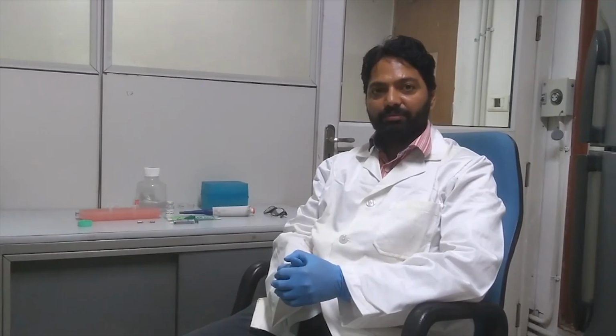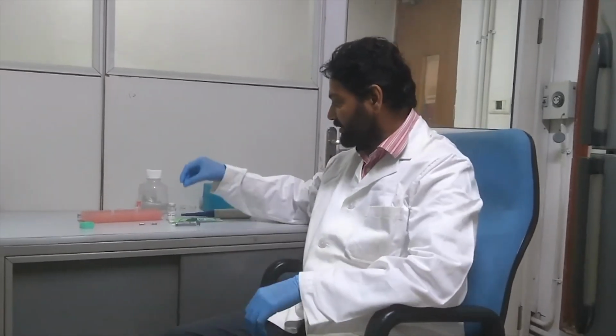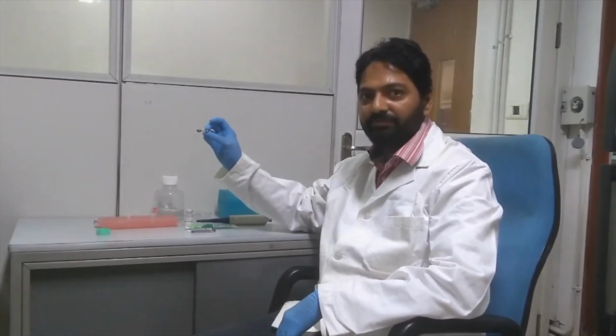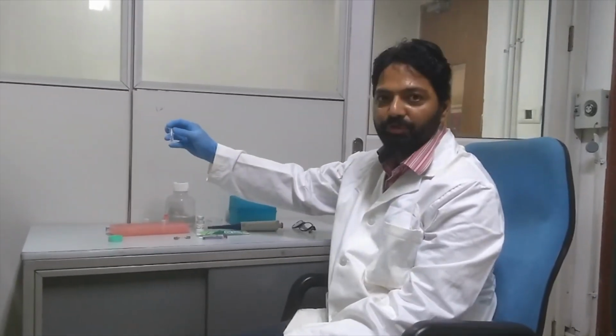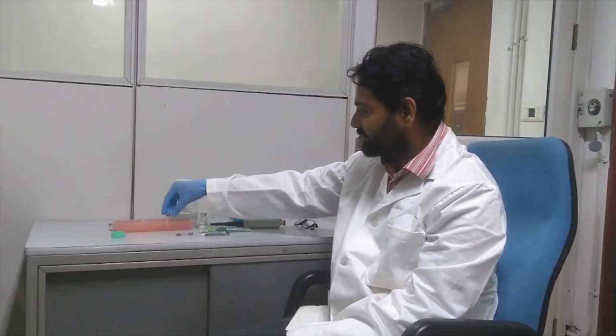I work in CSIR, CDRI. And in today's demo, we'll be discussing the different steps involved in the generation of antibodies in rabbits. For the first step, we require several things like Freund's complete adjuvant. Here it is from Sigma. We need a microemulsifying needle which has two openings connected with a fine needle. We need antigen which is purified and filtered, so there are no contaminations. It is a sterile solution of antigen.